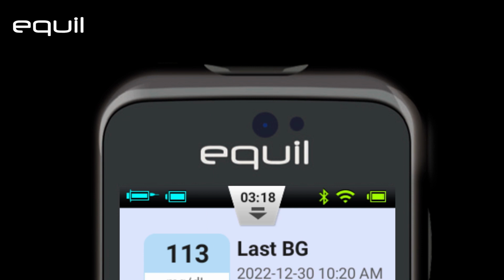As for the status bar, it'll be divided into 2 parts, separated by time. In the English version, the left part of the bar corresponds to the pump and is colored blue, and includes an icon representing the pump's battery status. It will show the charge decreasing gradually, unless the connection is lost with the PDA, so it will show like that. There's also an icon that shows how much insulin is left in the reservoir, in different degrees, and if the PDA wireless link is poor, it displays this symbol.